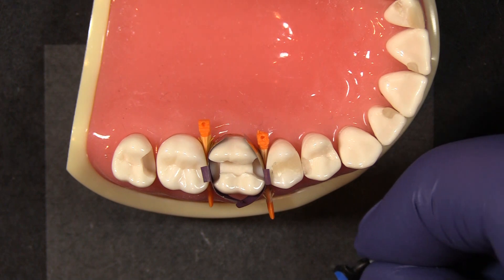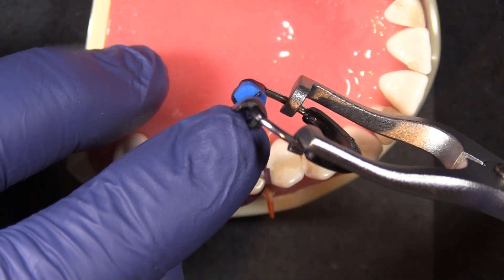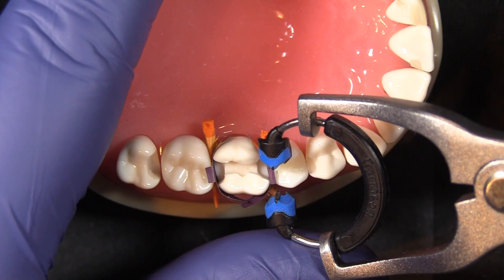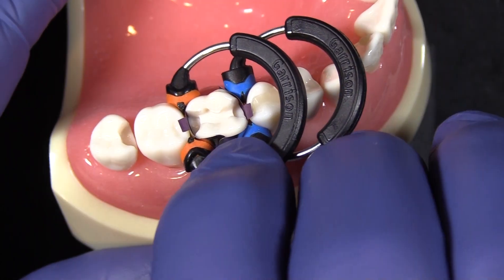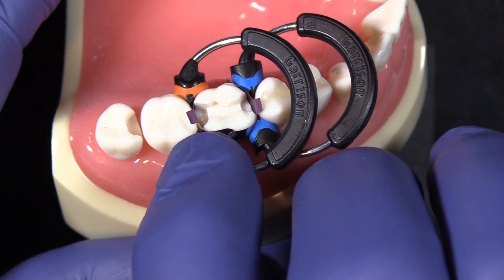Usage is identical to all of our soft face rings in that the little slot on the bottom fits right over top of the wedge, so placement is quite easy. We come in at just a little bit of an angle, rotate it down. We can put the orange one over top of it like that, and we still have the interface of the silicone and the band to help reduce the buccal and lingual flash.